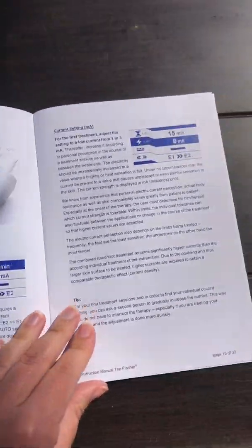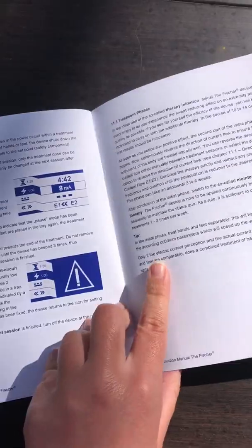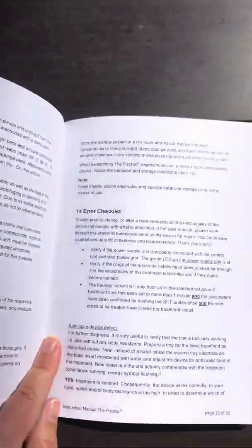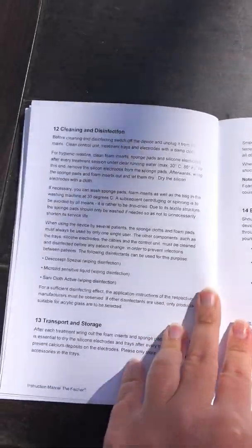Everything from how to set up the machine to customizing the interface, cleaning and troubleshooting. There were also lots of different tips sprinkled throughout which I found very user-friendly, so this definitely read more like a step-by-step guide.